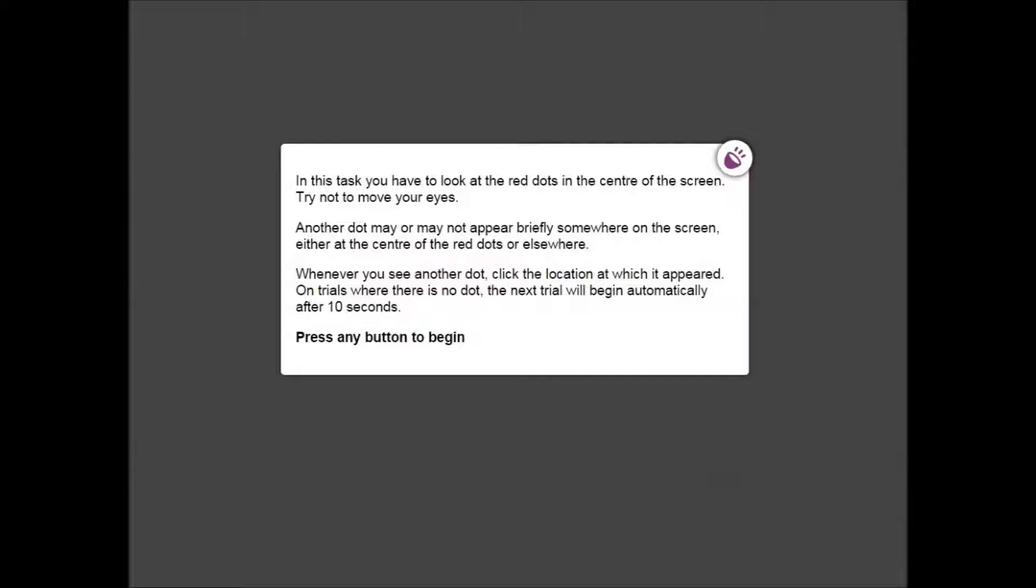On trials where no dot appears, the next trial will begin automatically after 10 seconds. Click or tap anywhere on the screen to start the trials.